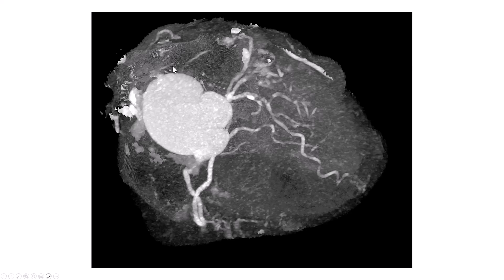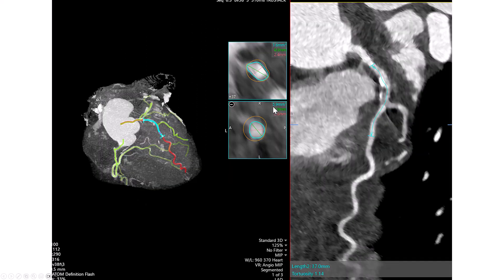We then have the maximum intensity projection, showing some calcium but not too bad at the bifurcation of the LAD in the diagonal. We also look at the plaque composition and it's mainly soft plaque with some calcium. One would go very long, to 37 millimeters, to cover from very proximal in the LAD all the way to the mid LAD.